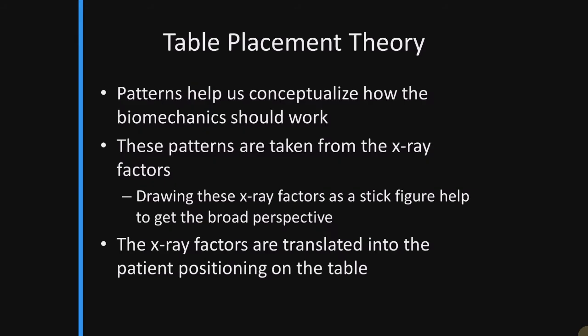The theory behind our table placement protocol is that the patterns of subluxation help us to conceptualize how the biomechanics should be working. These patterns are taken from the X-ray factors, which are done by drawing the lines, taking the measurements, and looking at stick figures that we'll be going over to help us get a better broad-based perspective as to how the overall biomechanics exist in that person's misalignment. And the X-ray factors are translated into the patient's positioning aspects of table placement.